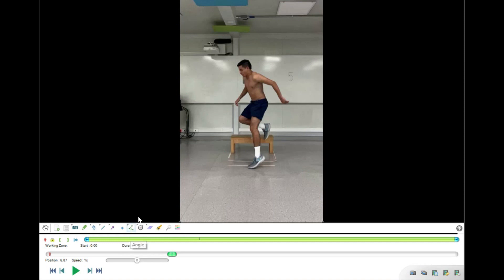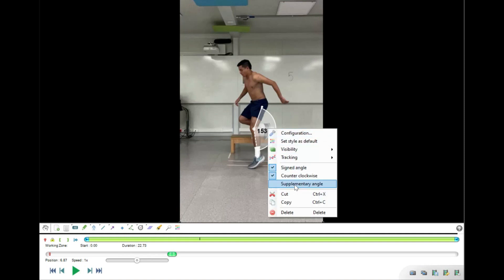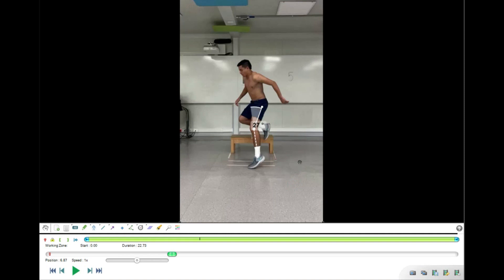To measure the knee angle we use the angle function of Kinovia and place the cross on the lateral epicondyle of the femur, close to the center of the knee joint. One dot goes to the greater trochanter and the other dot goes to the lateral malleolus or lateral ankle. The inverse angle reads 153 degrees, so the supplementary angle gives us a knee angle of 27 degrees. An error is present when the angle is less than 15 degrees, so in our case 27 degrees is more than 15 degrees — no error is present.